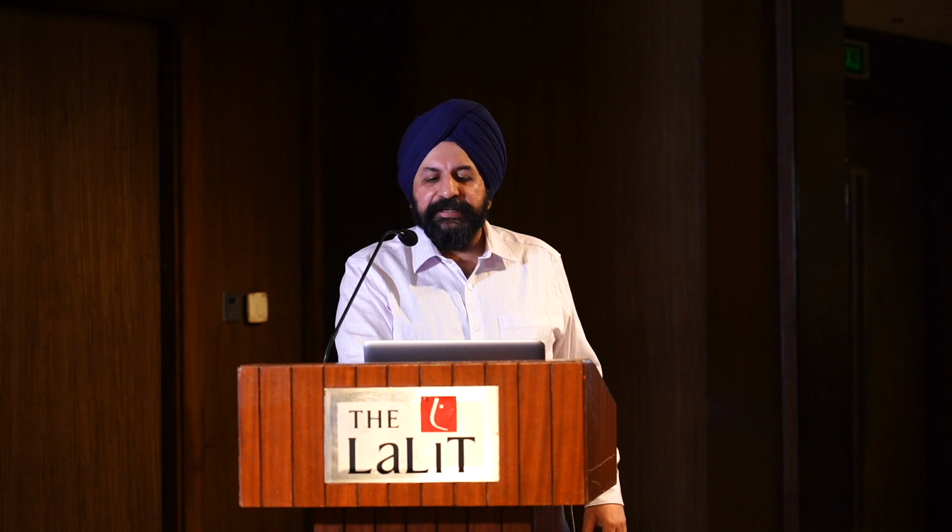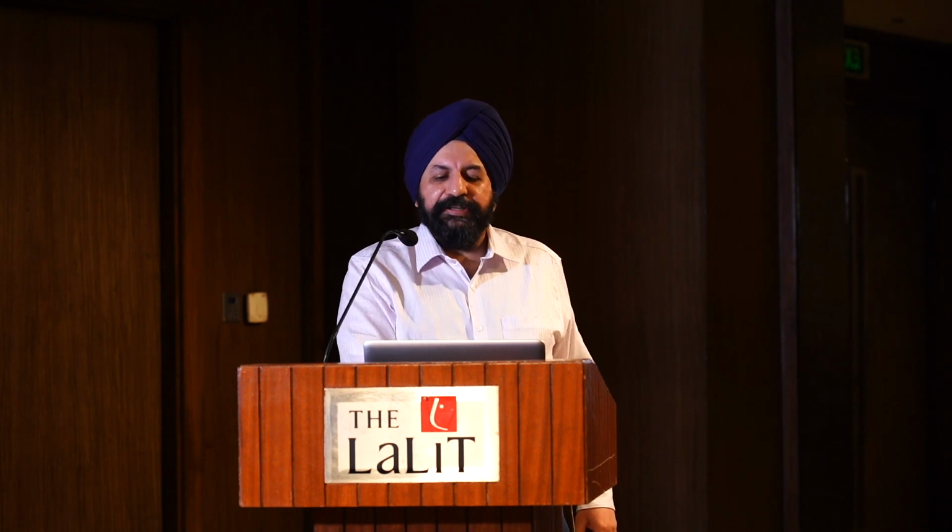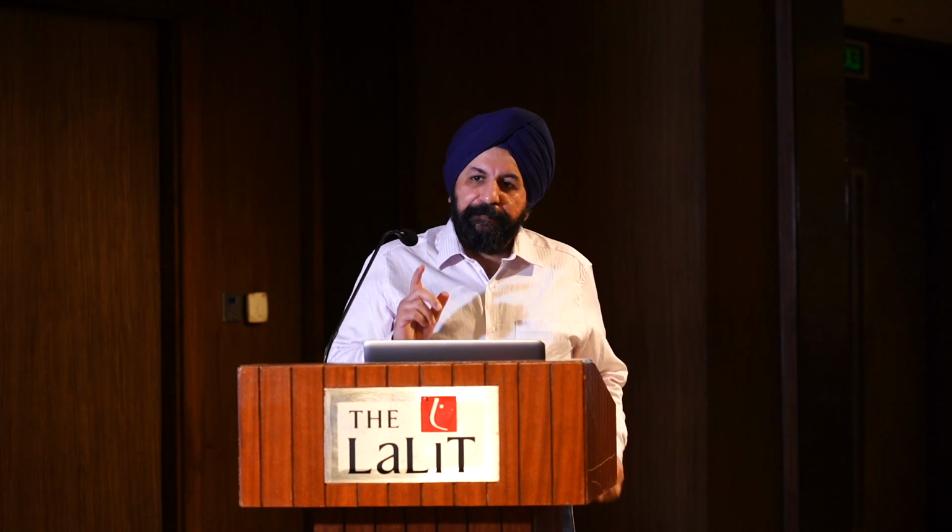So my normal range for HFC that we established in our lab was 0 to 0.4%. This is day 4, I am not beginning from day 1 for the patient. The HFC is increased to 3.7% and the platelet count is 82,000. If you look at the scatter plot, this green area above the monocyte, as I told earlier, this is the area of the high fluorescence cells. So the principle is whenever after day 4, the HFC jumps from day to day more than 3 to 4 times, usually the platelet recovery happens within 48 to 72 hours from that point.